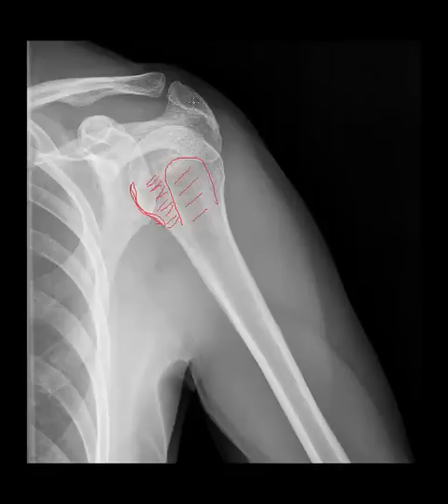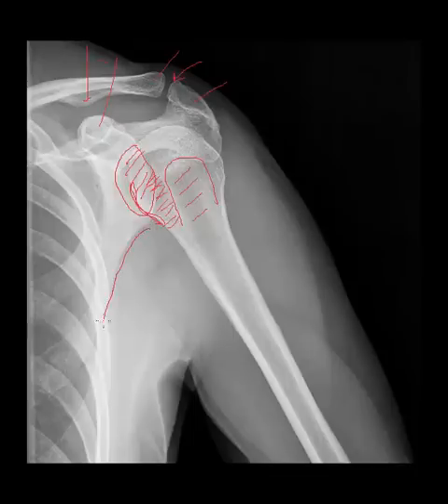This is the acromion process, here is the clavicle, acromioclavicular joint, conoid tubercle, coracoid process, glenoid fossa, axillary or lateral border of the scapula, inferior angle of the scapula, ribs, lung tissue, axilla, and deltoid musculature.